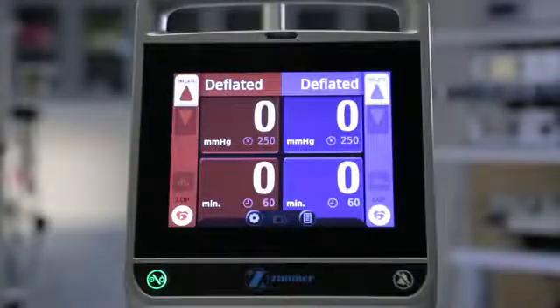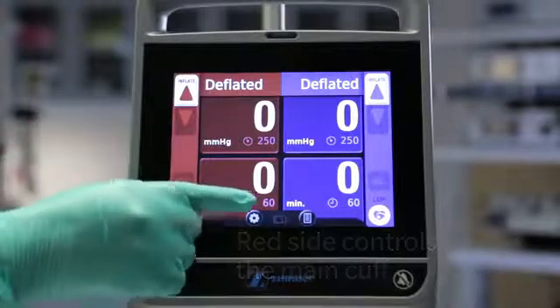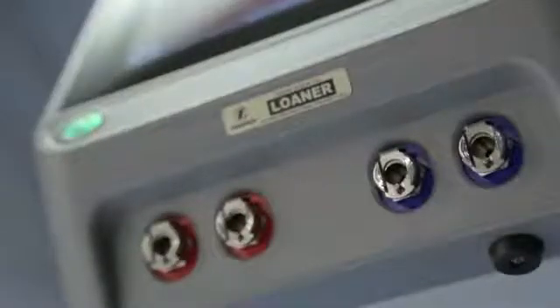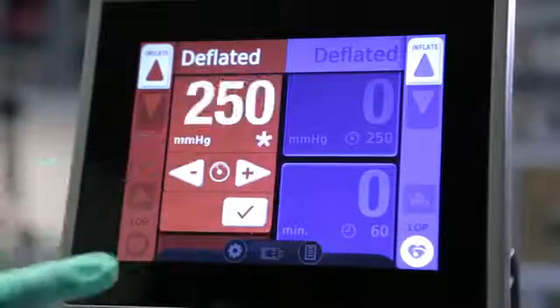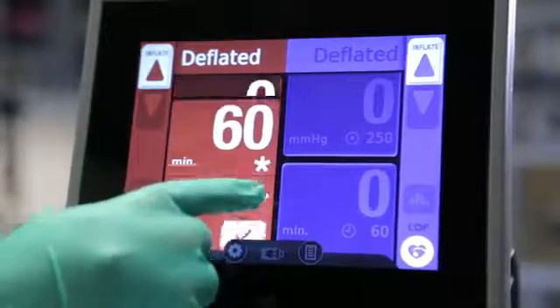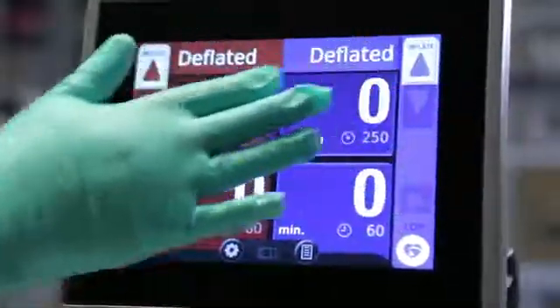The ATS 4000 touchscreen has two sides. The red side controls the main cuff, while the blue side controls the second cuff. The cuff connector ports are color-coded to match the corresponding screens. To prevent potential accidental changes, the screen requires intentional one-finger touches. Brushing, multi-finger, or palm touches will not activate the display.